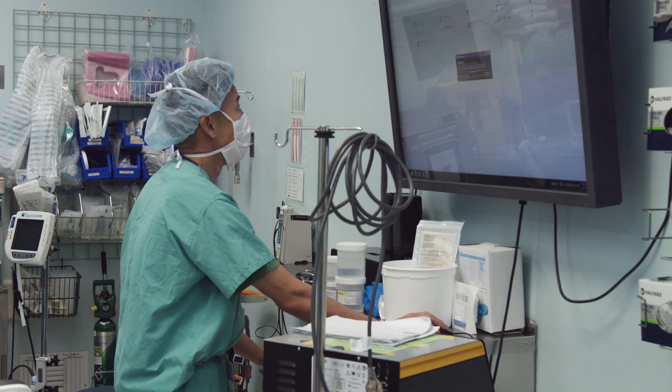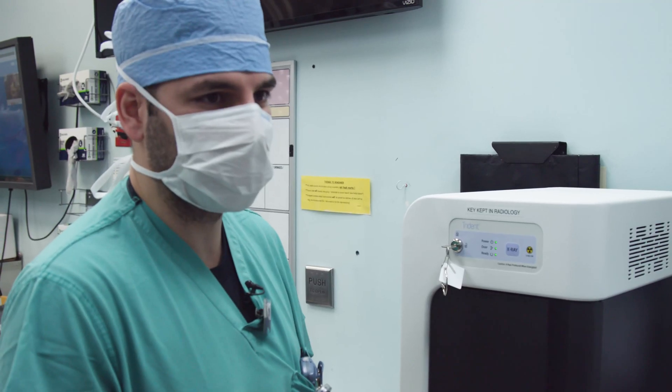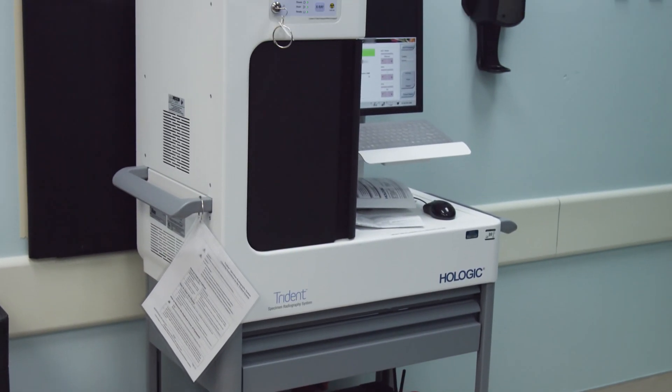Dr. Komenaka used to have to come to our department. Now we come to him. Any OR room he wants to set up in, we'll wheel in and follow him, and we'll just set it to the side. The specimen will be placed in the center.